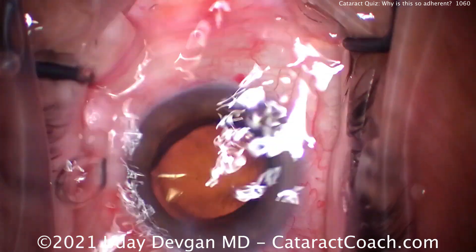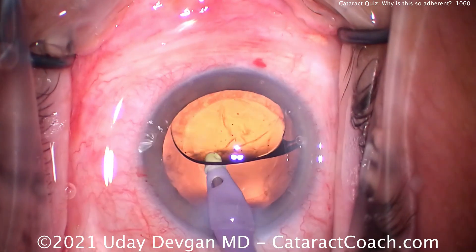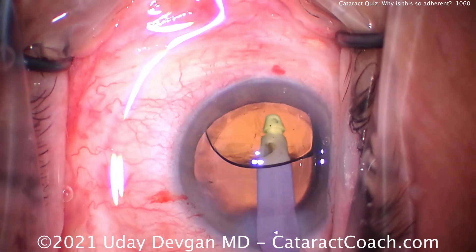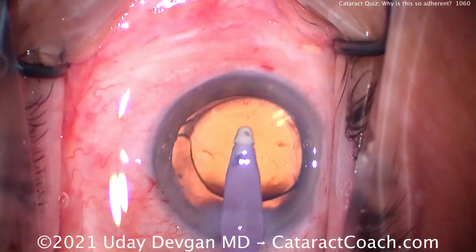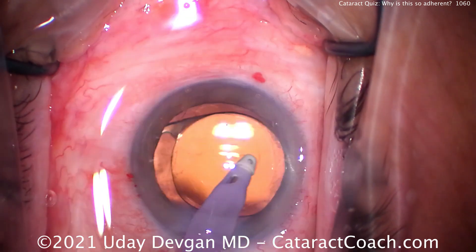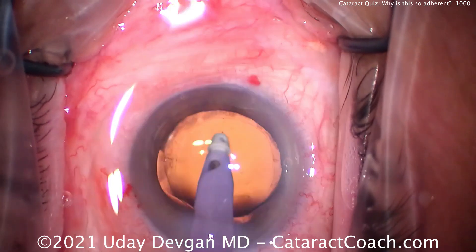Time to go behind the lens to remove viscoelastic. Remember, we ideally want the posterior aspect of the IOL optic to touch the posterior capsule. There's a little tiny lens piece there being removed very easily. Once the viscoelastic is out, we can go in front of the optic to clean up any residual lens material — there's a little bit of cortex near that air bubble. Okay, that's been removed.